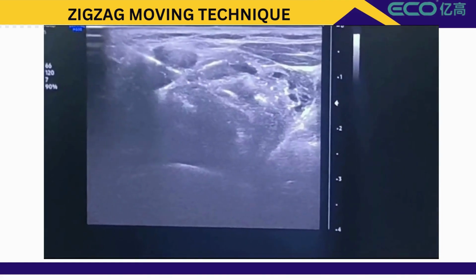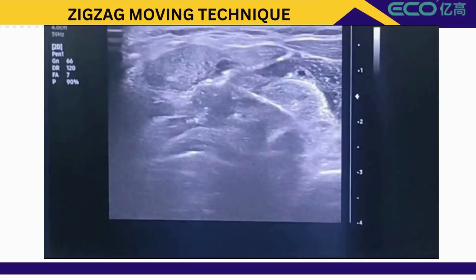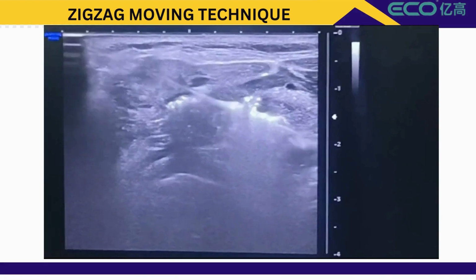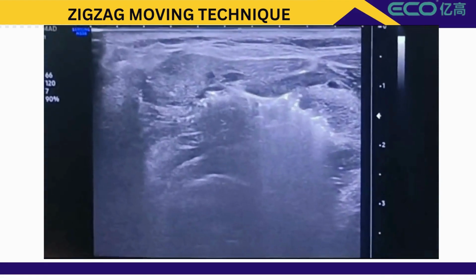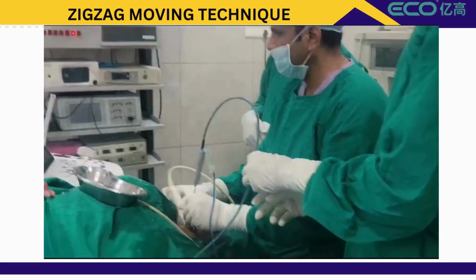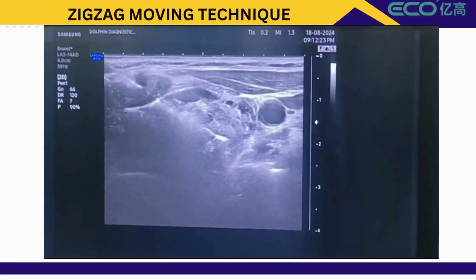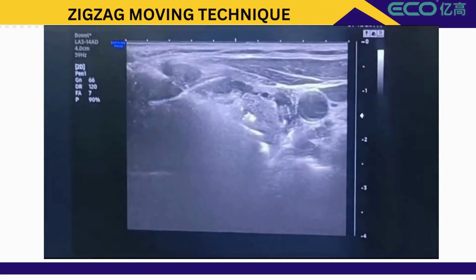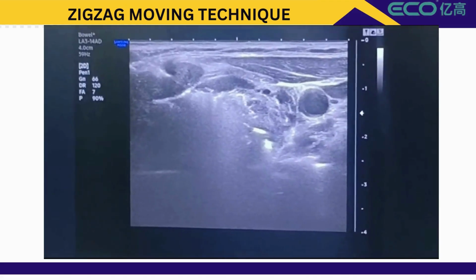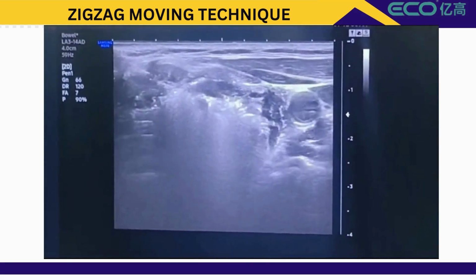Any surgeon, endocrinologist, endocrine surgeon, or ENT surgeon can easily do this maneuver. With the help of a radiologist, a multidisciplinary team can practice it. It is very easy compared to surgery. We save the thyroid gland, because we are not ablating normal tissue, only pathological tissue. So the rest of the thyroid works and releases hormone, and the patient will not become hypothyroid in future. Try to understand, that is the beauty of microwave ablation.